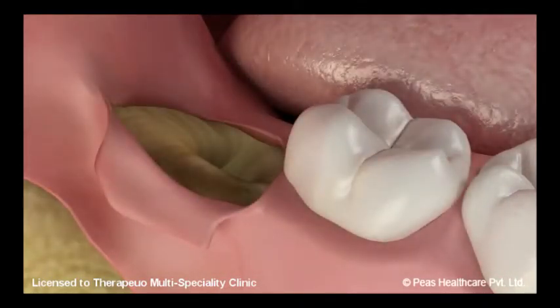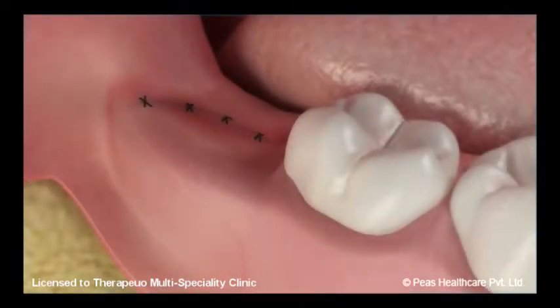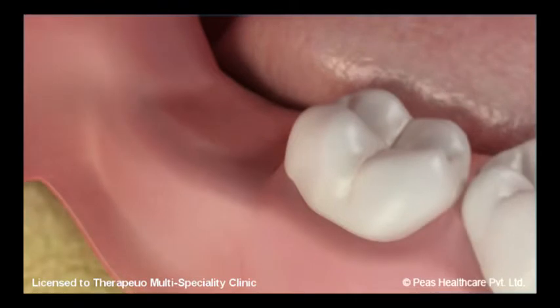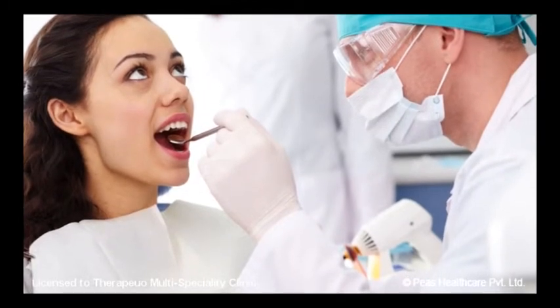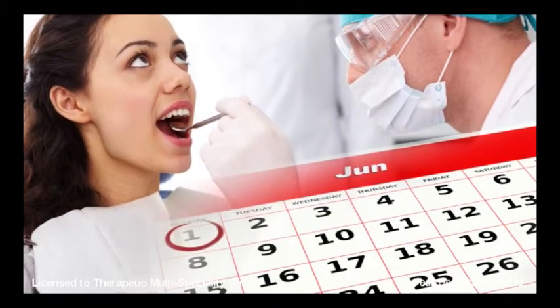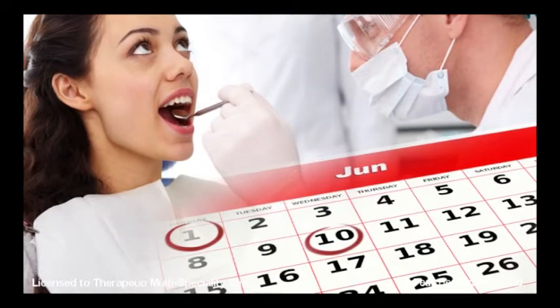Once the tooth is completely removed, the dentist will stitch up the gum tissue. These stitches may either dissolve with time or may have to be taken out at the dental office after 7 to 10 days, depending on the suture material used by the dentist.